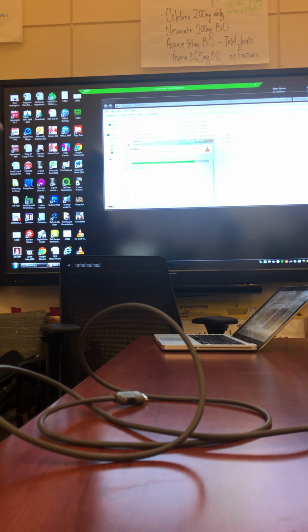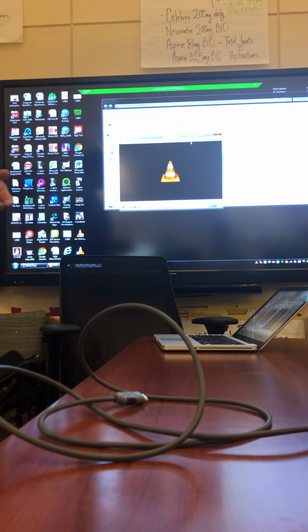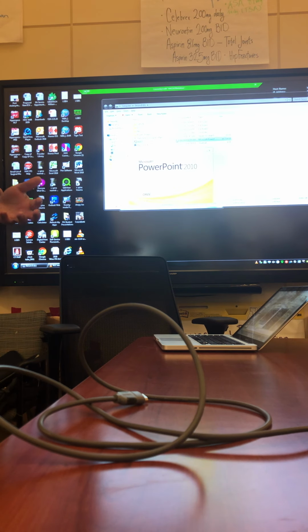It's a very hard scan to do and to do correctly. It has its role. It's very useful, but it's for a certain patient. The patient who's unstable, who you can't get to the CAT scanner, who you want to know is there intra-abdominal free fluid, is there a pericardial effusion with tamponade, and you want to go and take them straight to the OR without a CAT scan.